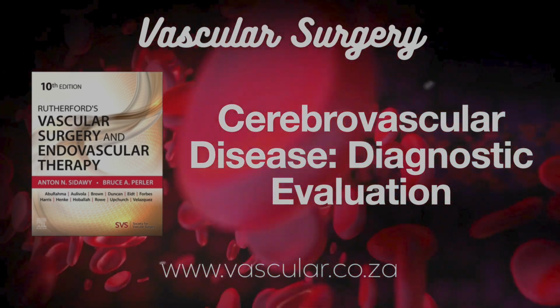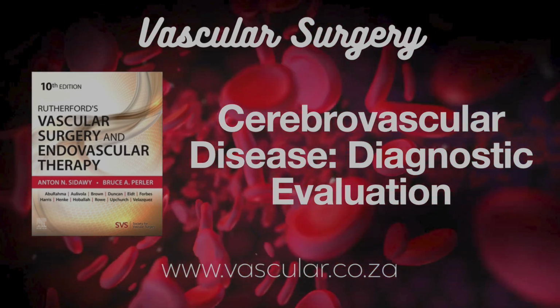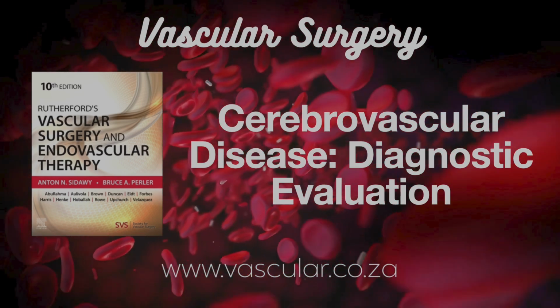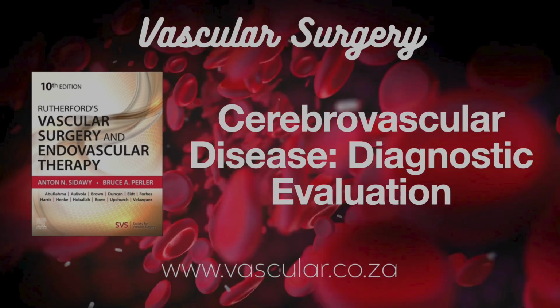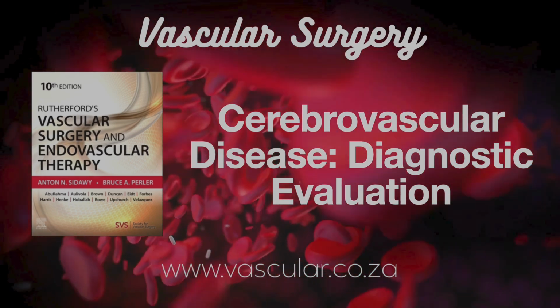Exactly. The goal is to better identify which people with asymptomatic stenosis are truly at high risk for stroke. We're seeing computerized analysis of DU images, looking at plaque texture, things like grayscale median, plaque area, juxtaluminal black area, trying to find markers of risk.